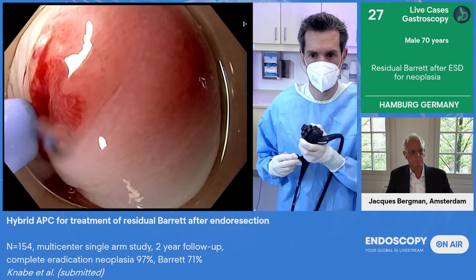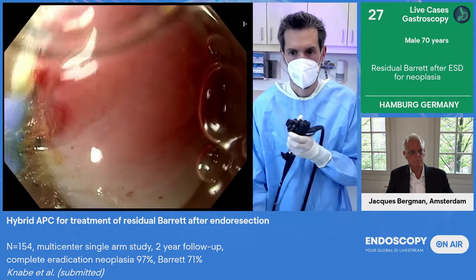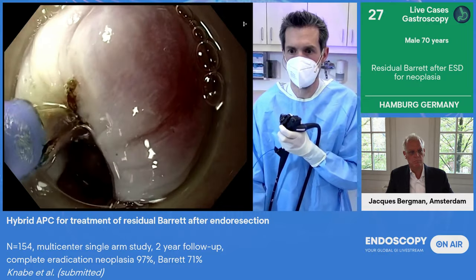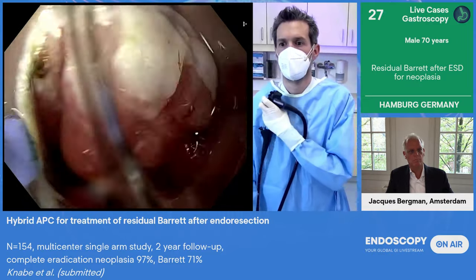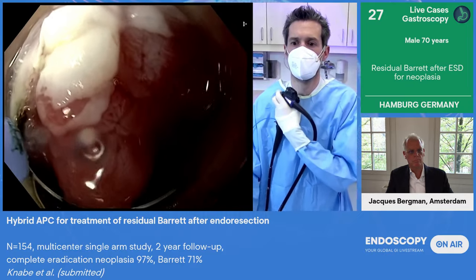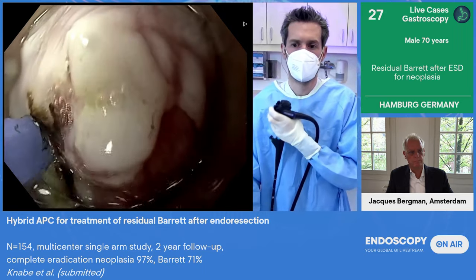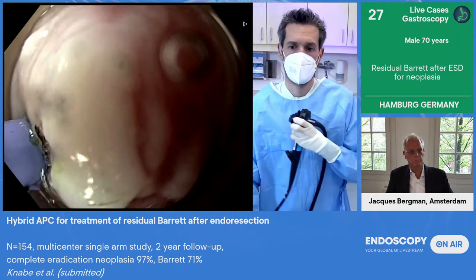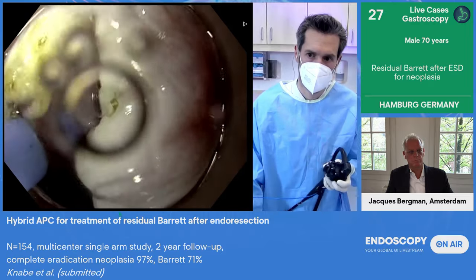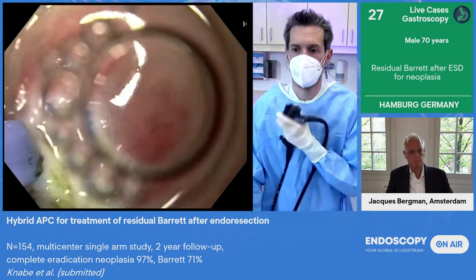So I'm going a little bit back with the probe, and then we can see the APC working. A little more distance, there you can see. The effect on the right side of this area is not good enough, so I'm going to do a little more over there. And after the first round of ablation, we're going to do a second round. In between, we have to scrub off the treated mucosa.